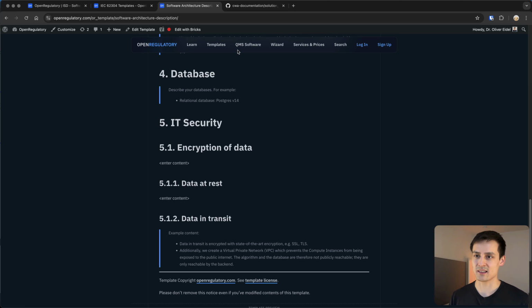Our opinion is quite a radical one: for your internal purposes, for project management and communication with your developers, create whatever is the most useful for your development. But that might not be the right thing for regulatory compliance. For regulatory compliance, you have to create this. So I would advocate for you to create this for regulatory compliance. But the likelihood is super high that it's not super useful for your team internally. So go ahead and create other stuff which you might use for your internal purposes.